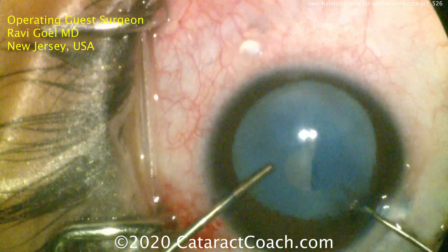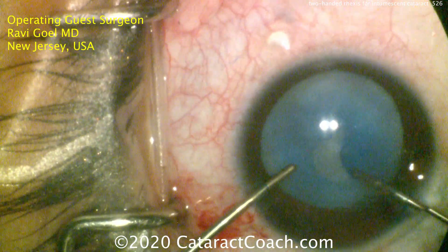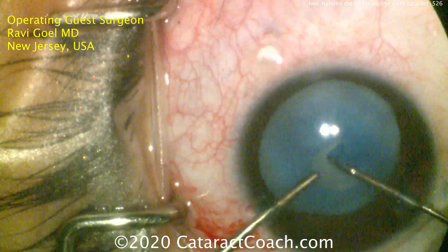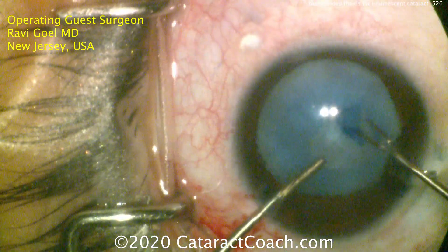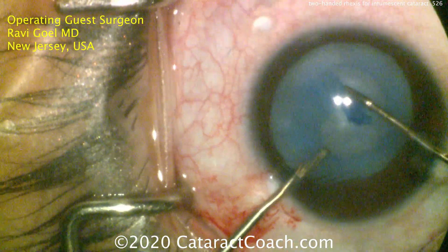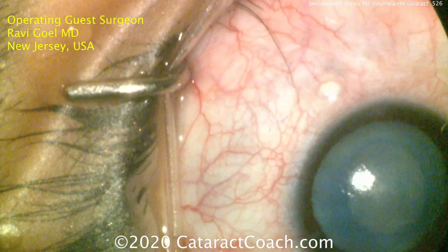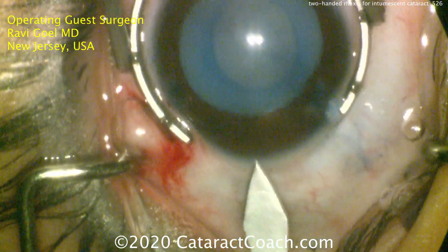Here are the micro 25 or 23-gauge forceps — tiny little forceps that can go into the paracentesis and grab the capsule, just like you're seeing here, and continue the capsulorrhexis. This is a young patient; look how elastic the capsule is. Using TriPan Blue does help to limit elasticity. But even then, look how he's pulling inward to create the rhexis. And it's just done — that's a beautiful rhexis. This is a very tough technique because of the intumescent cataract, but also because the patient's so young. Dr. Gohl did a beautiful job there.